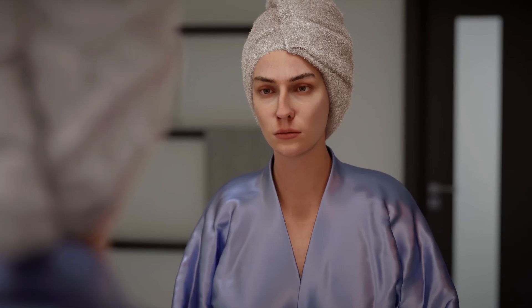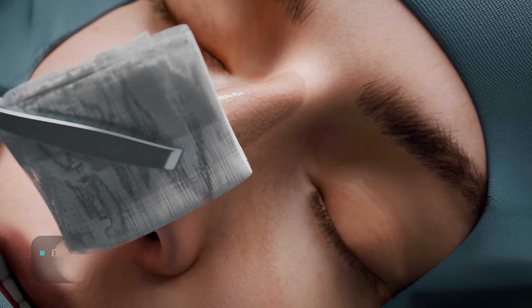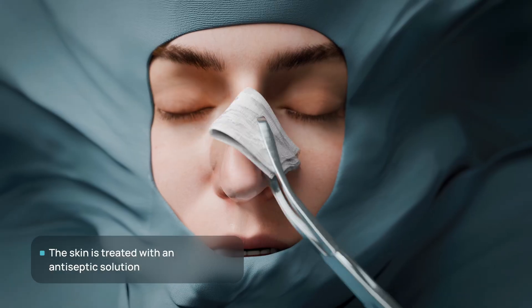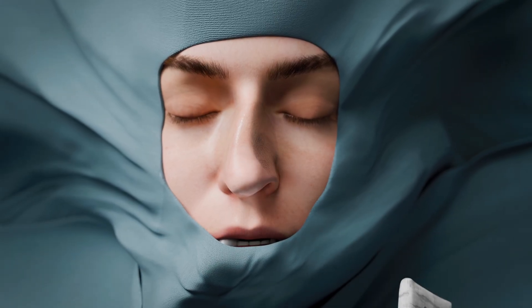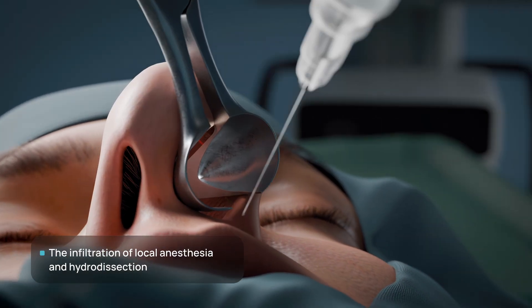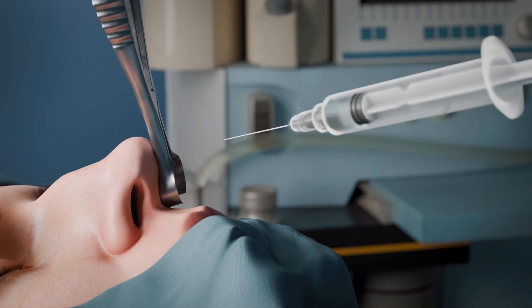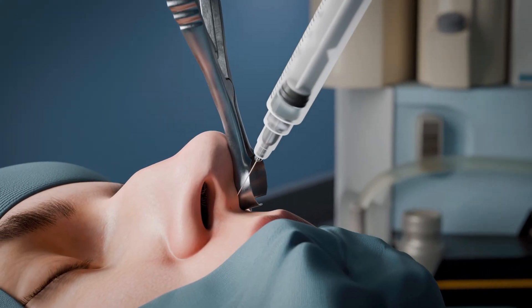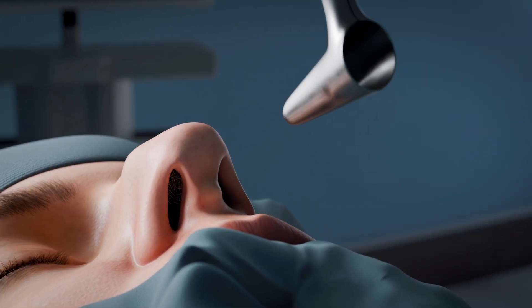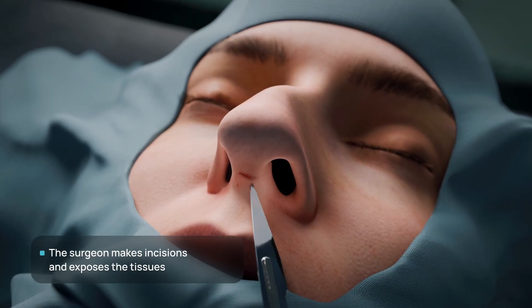The main advantage of open rhinoplasty lies in the surgeon's ability to directly visualize all operative maneuvers, thereby enhancing the precision and predictability of the outcome. Open rhinoplasty is performed under general anesthesia. In addition, local infiltrative anesthesia is administered using a combination of a local anesthetic and epinephrine. This provides profound analgesia, temporary hemostasis through vasoconstriction, and facilitates hydrodissection.